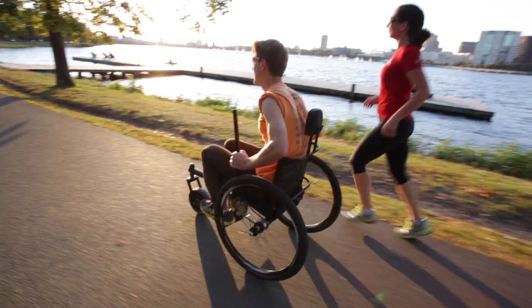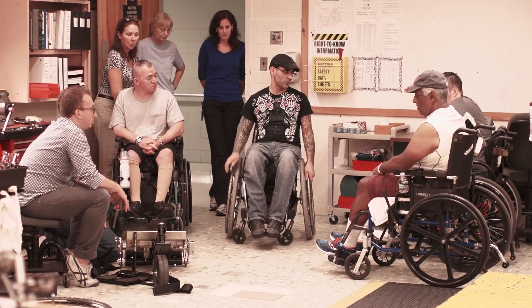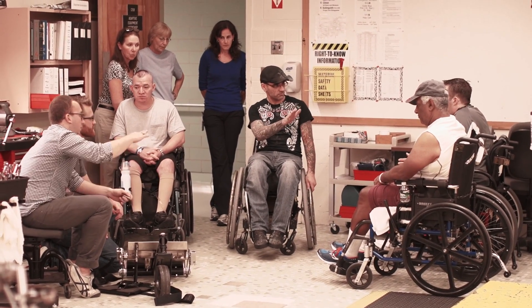Rather than something that's really long designed for outdoor use, we could design a drivetrain that was compact. The great thing about working on the Freedom Chair is, one, it's an amazing engineering challenge. But probably more importantly than that, it's an engineering challenge that really impacts a lot of people.